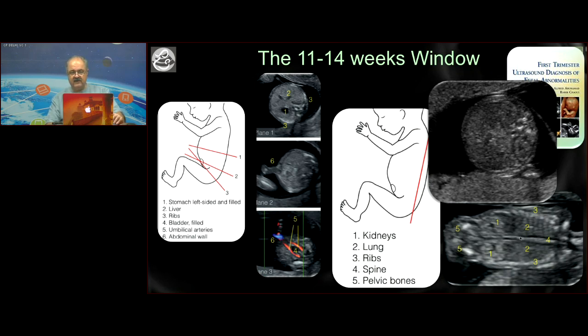Very often, the kidneys might stand out much more in a posterior coronal section of the fetus, in which you might see most of the ribs, part of the spine, and then these two echogenic areas at the back, which appear fairly bulky, and those are in fact the kidneys. Remember you're on the right plane if you're seeing the iliac wings, and then you won't mistake these. Usually the reniform shape stands out so well that you will know this is a kidney, and you don't really require any clues beyond that.